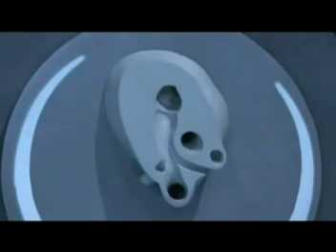And in this situation it shows up very clearly, partly because it's perpendicular and partly because it's on the other side of the ascending aorta, which means there's a rapid change in densities which allow for the walls of the right branch to look quite marked and obvious on the scan. In fact, sometimes it can look almost as bright and as large as the aorta in this view.